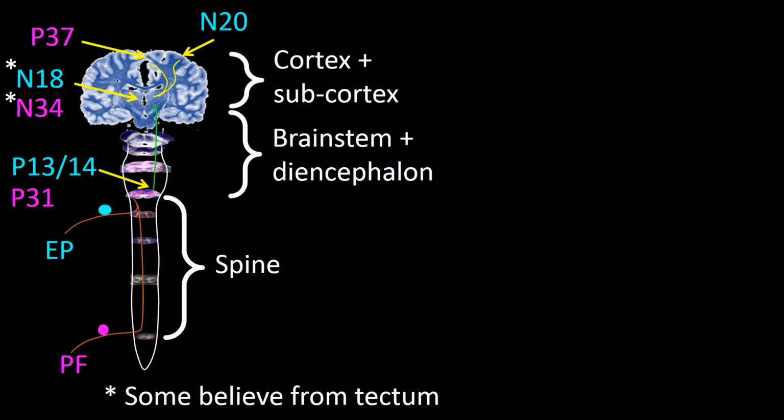Somatosensory evoked potential can also be theoretically used for horizontal localization, but the use in this endeavor is much less rewarding. Horizontal localization can be achieved at any of the three segments, but is only partially reliable in the spine and in the brain.